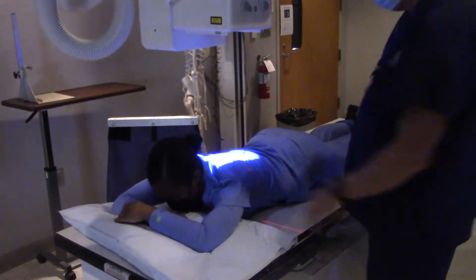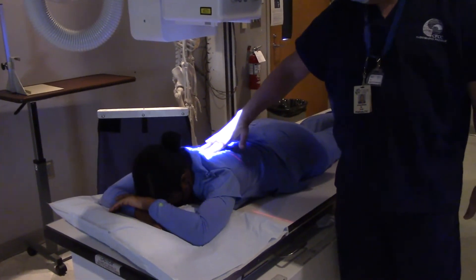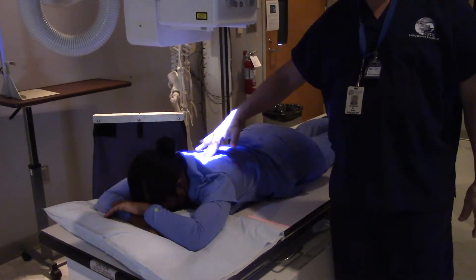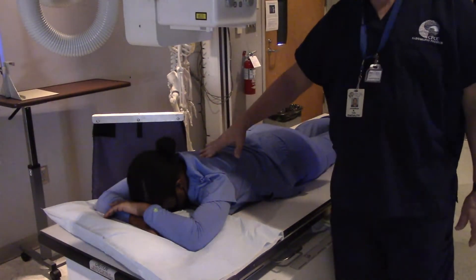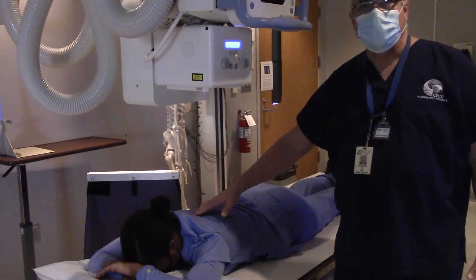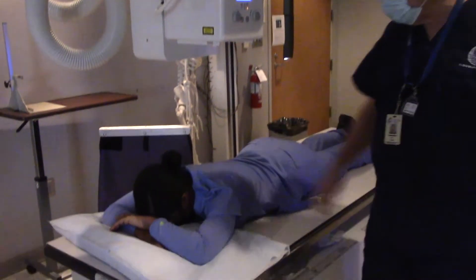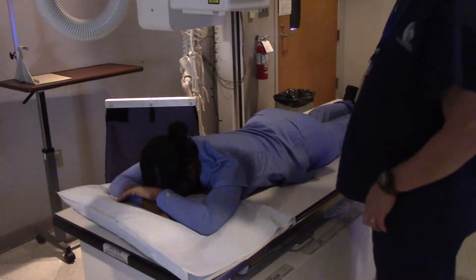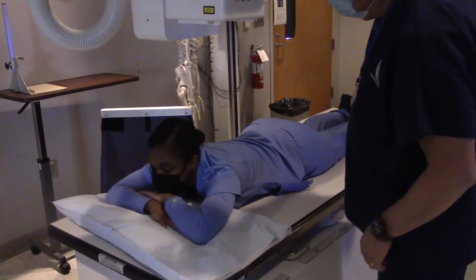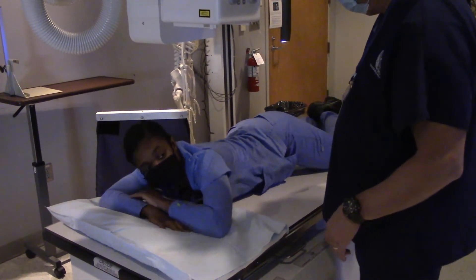Now where is the patient's esophagus? Well, the patient's esophagus is in the mid-sagittal plane, lined up basically with the patient's spine. So if I'm going to get a good look at that esophagus, what do I need to do? Oblique the patient. Exactly. So ma'am, if you could, what I'd like for you to do is roll up into an RAO position with about a 35 to 40 degree obliquity.